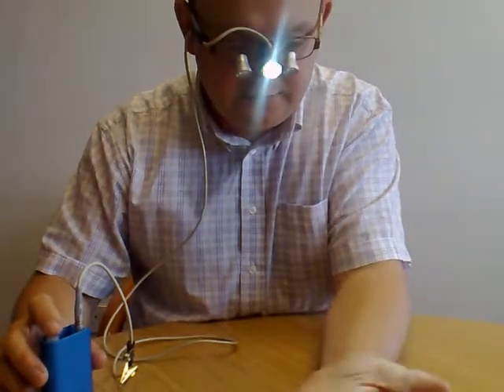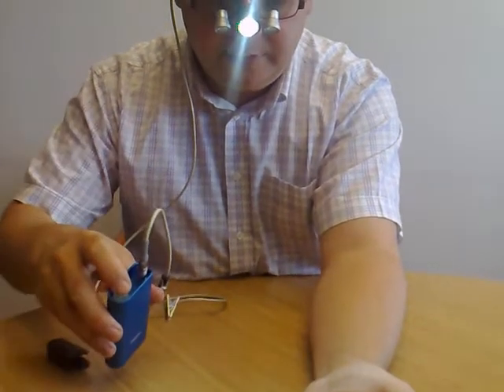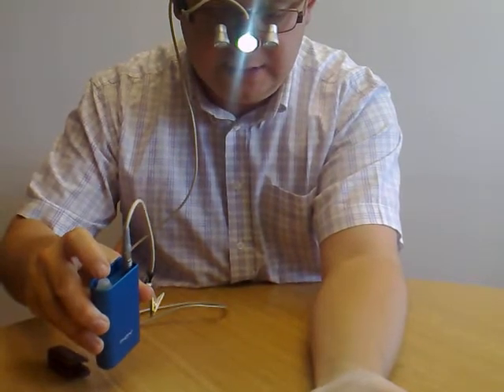Now, to dim it down, if you'll excuse me, I've got to put my hand in front so I can see that it's dimming. You basically hold the button for a little while and then let go and it should dim down a bit, which you can see there.